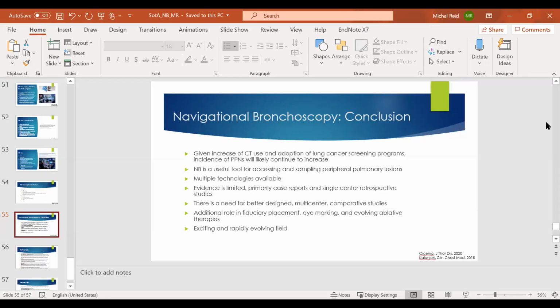I am overwhelmed by the amount of technology that's currently available. I literally knew that there was navigational bronchoscopy and EBUS, and that's it. Oh, maybe radial, I knew about that too. So what do we have here? We have the Veran system, the Veran navigational bronchoscopy. We have EBUS, and the radial probe. We have fluoro, which you probably know about. Whether Dr. Goles plans to buy anything else with all his millions of dollars, I don't know.